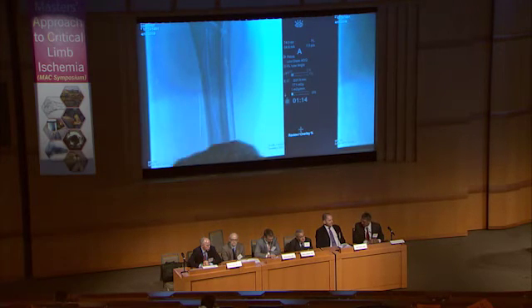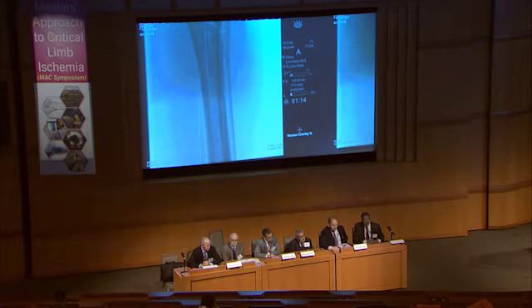So could you cause damage to the profunda artery itself or thrombose it back? That would be highly undesirable, is that right, to put coils through the profunda? I don't believe it would be such a simple task.